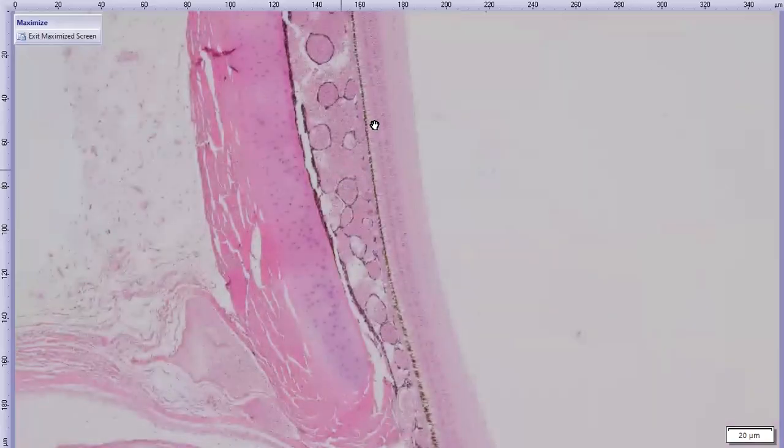So this is the choroid. And if you're sharp-eyed and you understand what you're looking at, you'll see that this choroid is just filled with red blood cells, way more than one would expect physiologically. And I'm not completely sure I know why that is, but I have a strong suspicion. My suspicion is that this animal, and we see this in horses sometimes too, was euthanized in the postmortem room and then held by its feet upside down so that the head dropped to the bottom and all the unclotted blood rushed to the head. And I think that's why we have all this blood in the choroid. So don't worry about that.